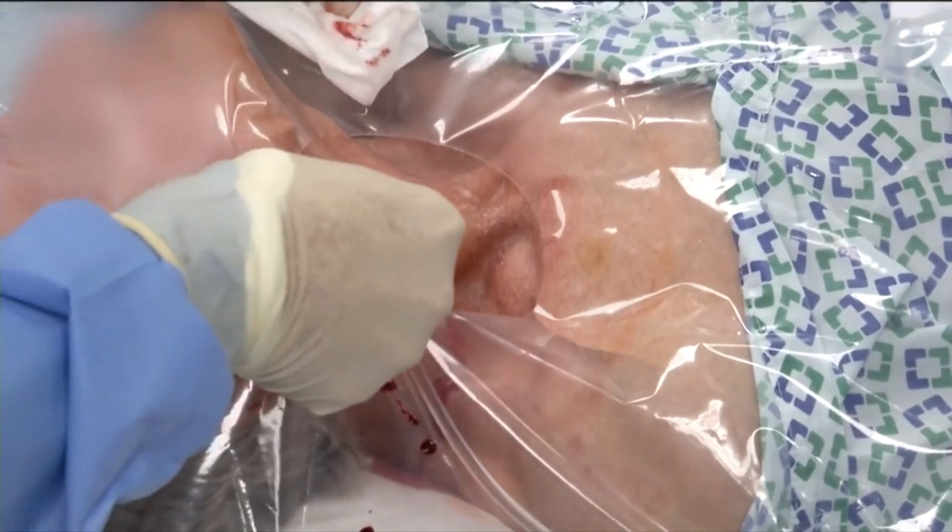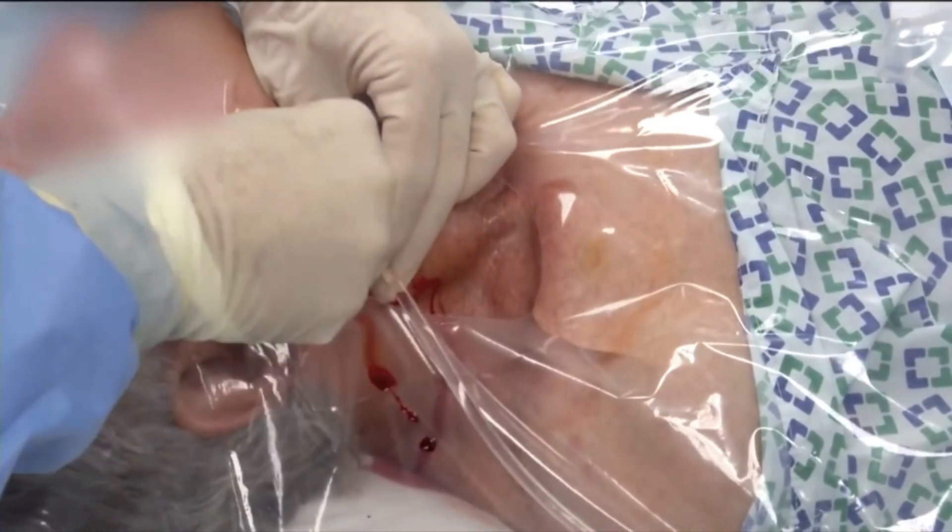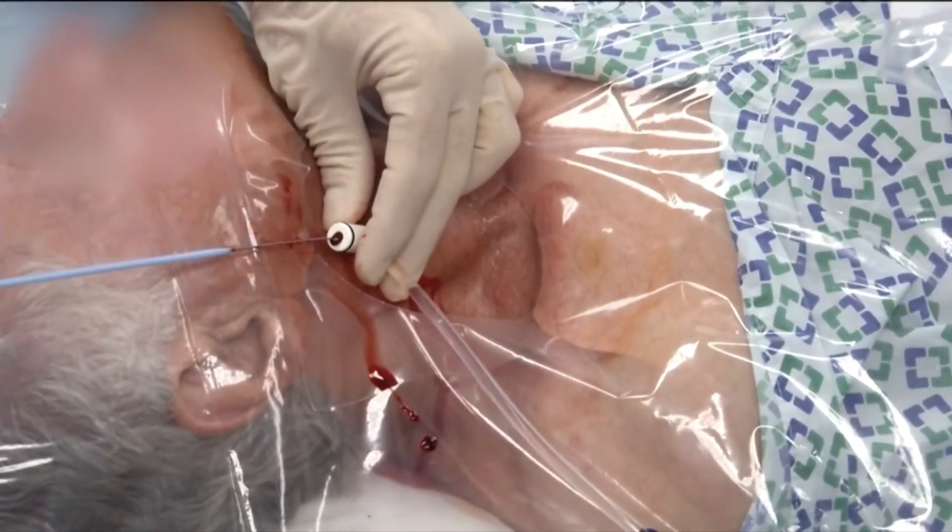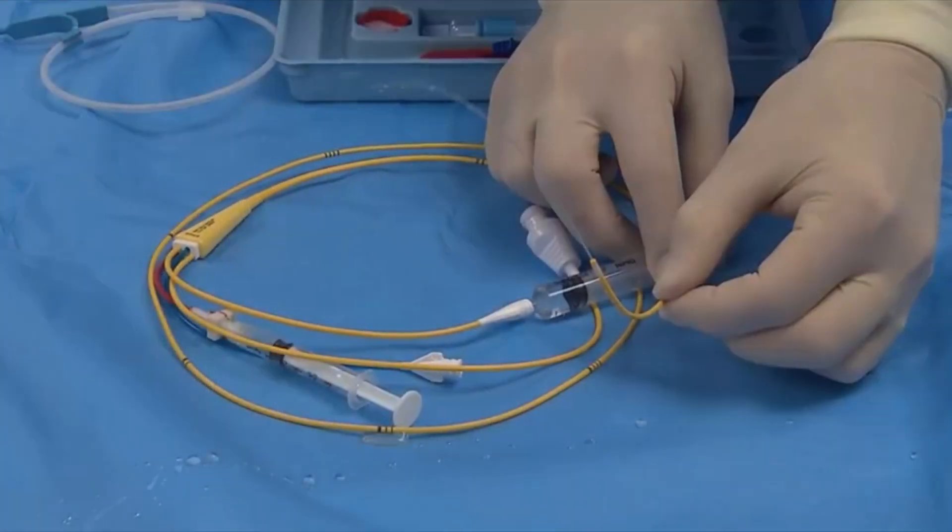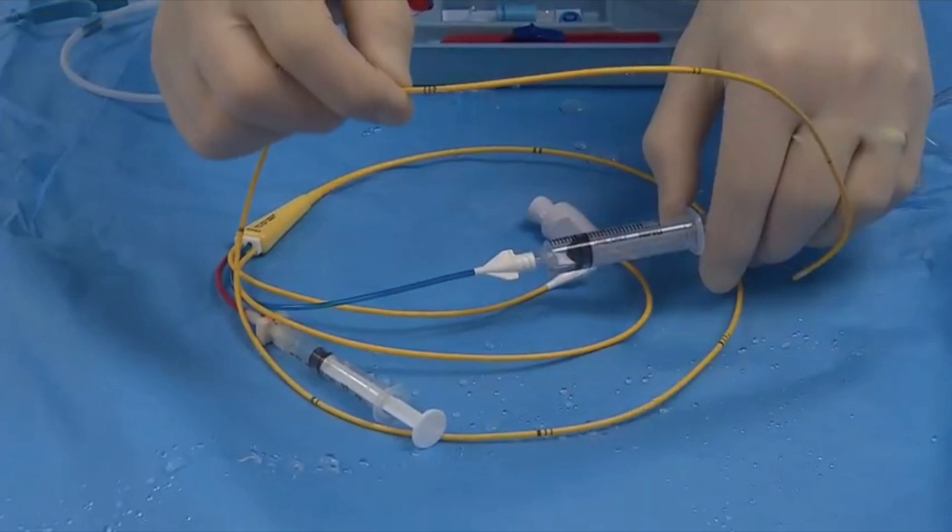Number 8: The health provider will place an introducer into the patient. Number 9: The provider will then be prepared for the Swan-Ganz insertion.